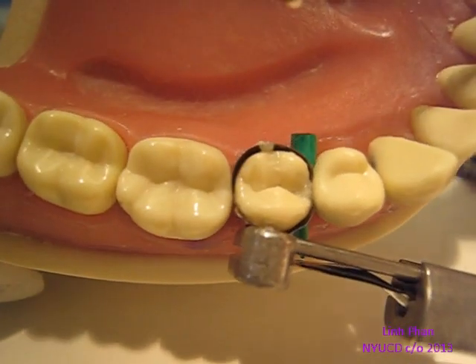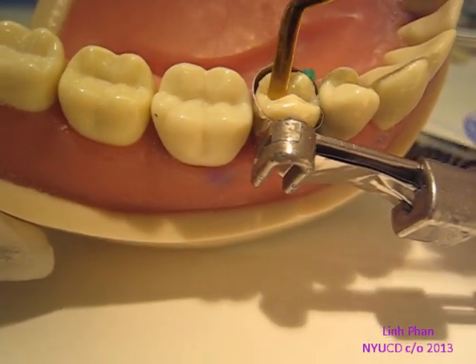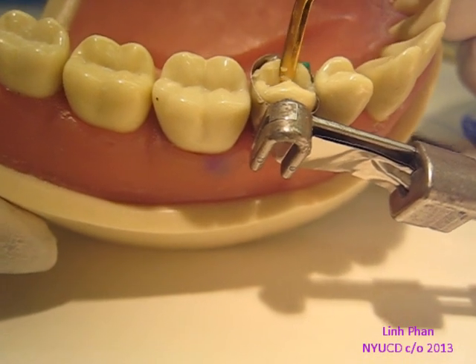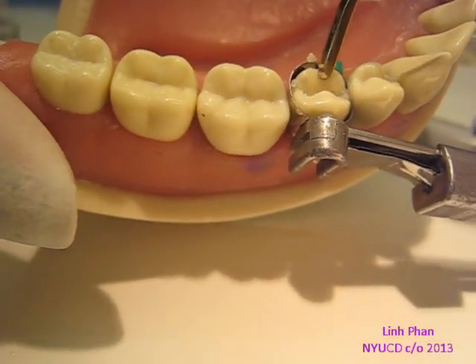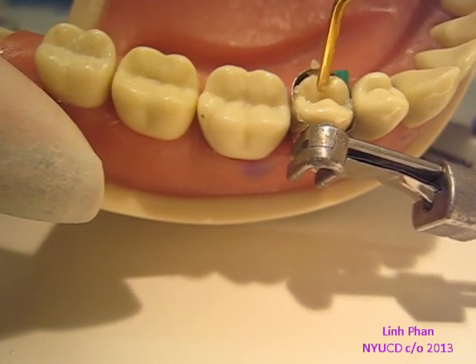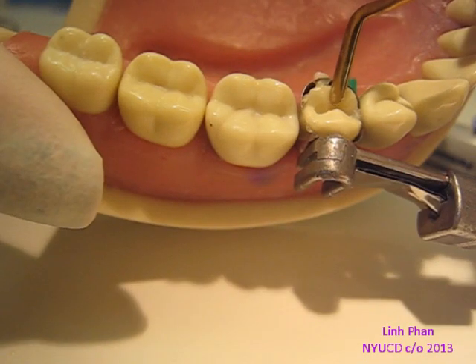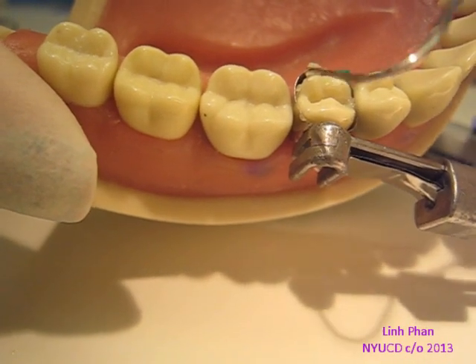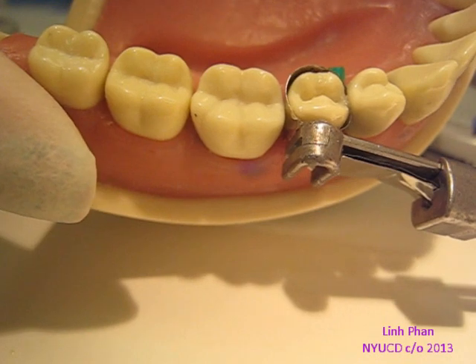If you have too much composite, just get rid of it. Using the cusp as guidance, we're going to shape. Keep in mind, if it's a Y-shape premolar, there's a groove here. When you're putting your composite in, you want to keep that groove there — don't try to make it flat. Just work with the cusp and keep that groove there. All the extra composite that you don't want to cure, make sure you get rid of it, because if you don't, when you do cure it, it could stick to things you don't want it to stick to, and it'll be harder to clean up.